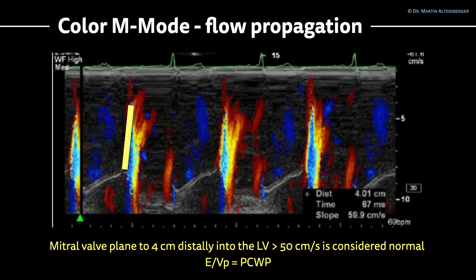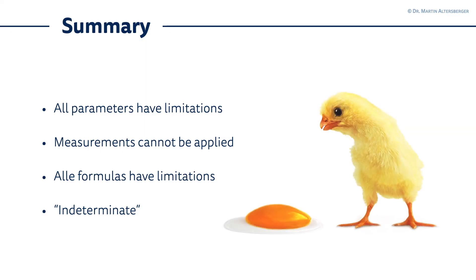You can see it quite nicely here. You measure from the mitral valve plane in color M-mode 4 centimeters distally into the LV; above 50 centimeters per second is considered normal. If it's below 50 centimeters per second, there may be elevated filling pressures. The E-to-propagation velocity ratio can also help calculate the pulmonary capillary wedge pressure, though this measurement has several pitfalls and it can be difficult to delineate the mitral valve inflow or mitral valve planes.